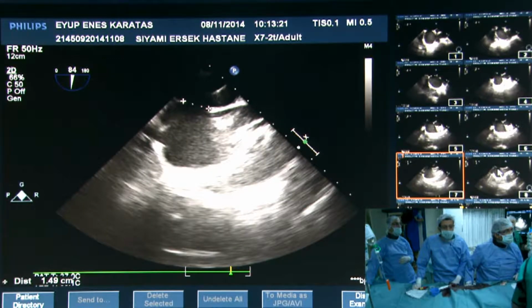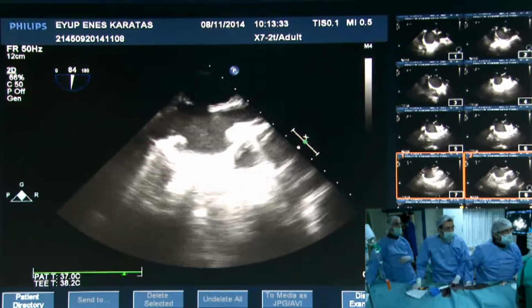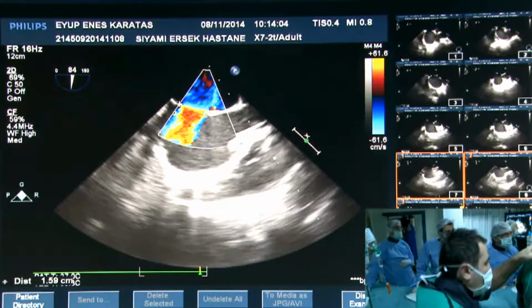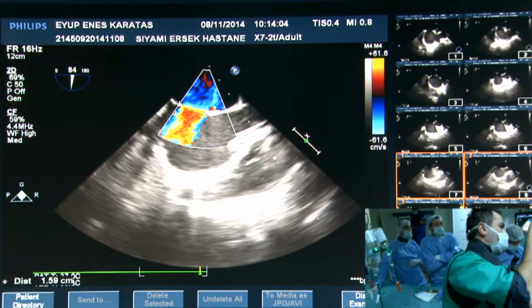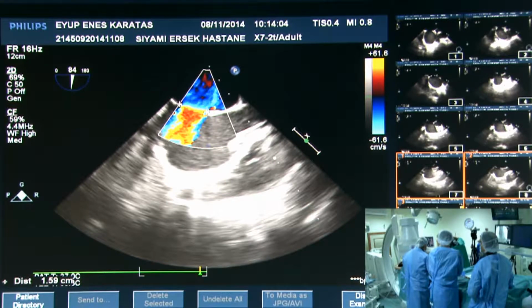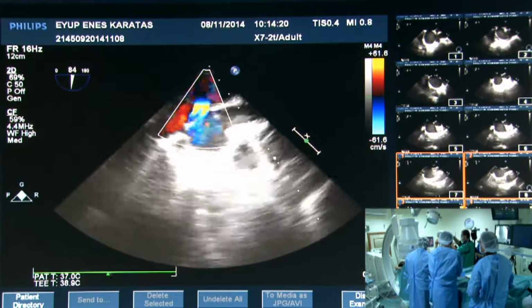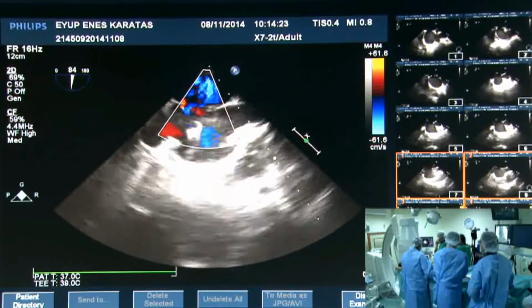Or do you think balloon sizing? You just tell us what is your routine practice. Well, personally, I would recommend balloon sizing in all cases, particularly in this case. You recommend balloon sizing? Well, routinely I do balloon sizing. I wonder if you do the same, or there are other opinions about that. What do you do routinely? You see in this picture the color flow diameter is 16 millimeter. Routinely we do balloon sizing in my practice.